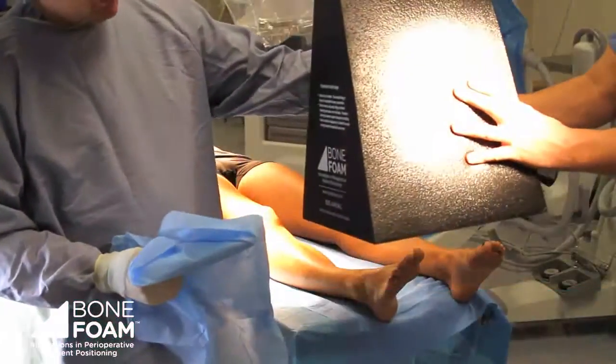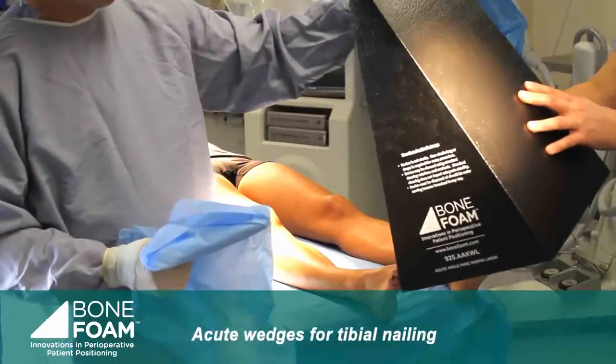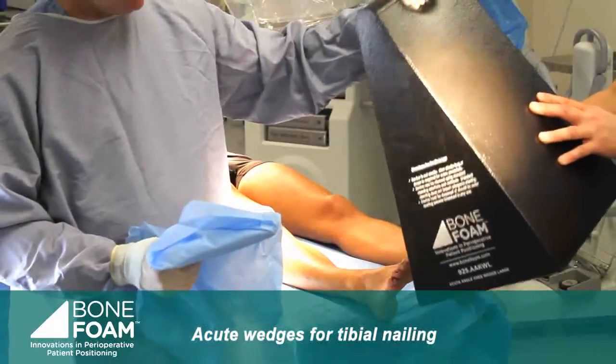I'm going to show the acute triangle that I use for tibial nailing. It's a nice soft surface for the nailing procedures, and what happens is that the knee will be supported by this relatively stable platform.